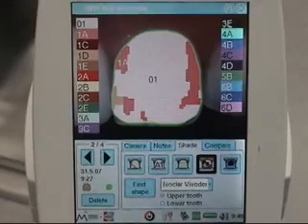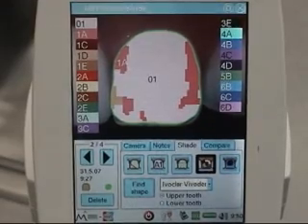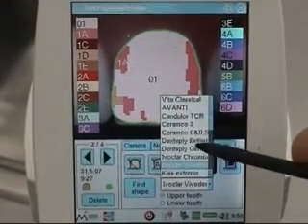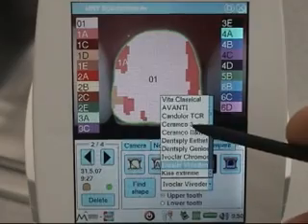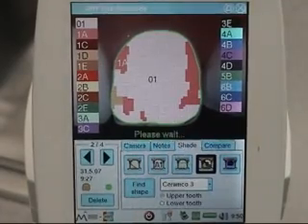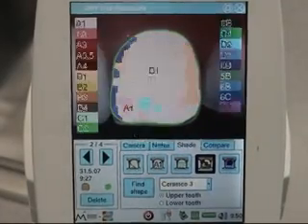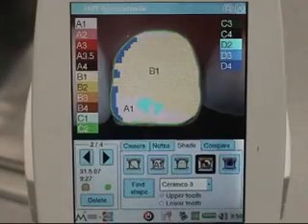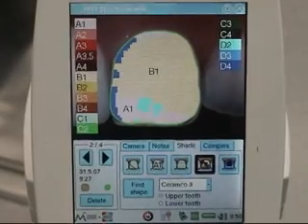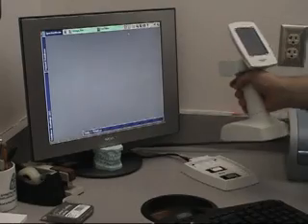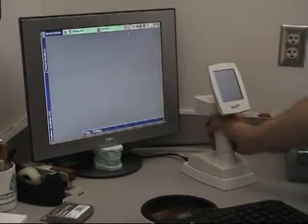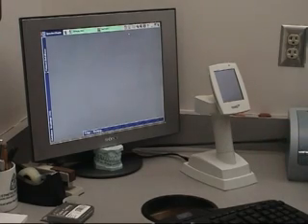The unit also allows you to change shade guides for shade matching. When you are done acquiring images, return the micro to its base unit connected to the computer.